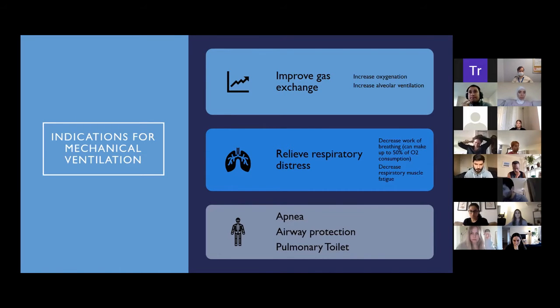Regarding CO2, similar way, right? You have a patient that has hypercapnic respiratory failure for whatever reason, for example, a COPD exacerbation. Going from a nasal cannula to a non-rebreather is not going to help at all, because what you need to provide is some minute ventilation support.